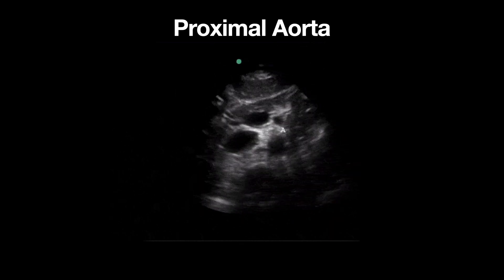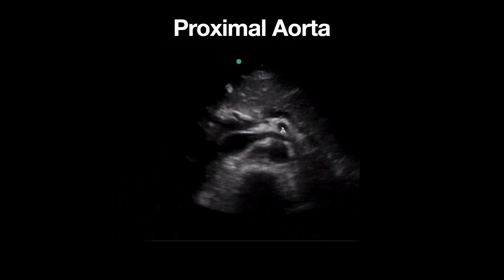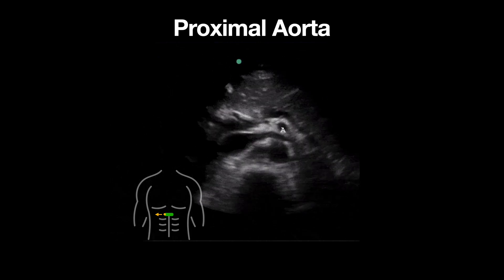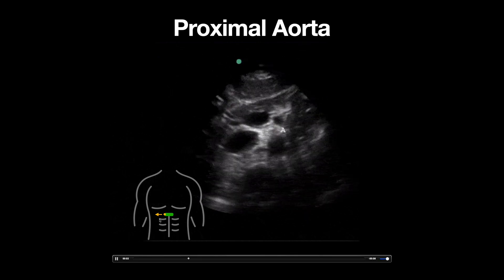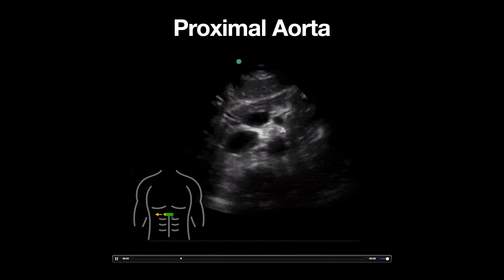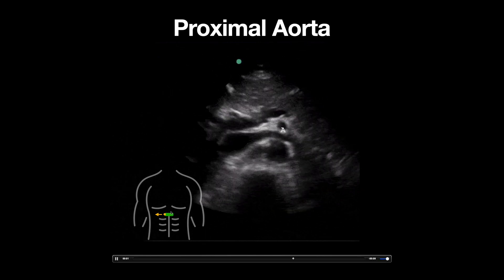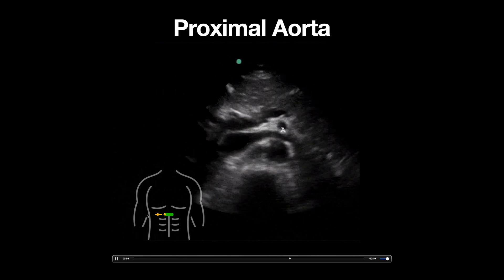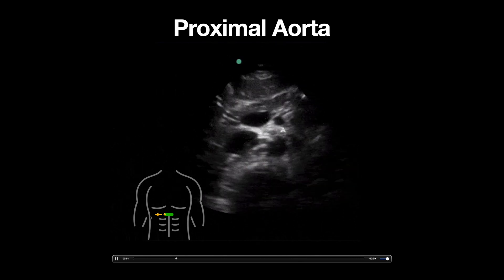This is an ultrasound clip demonstrating the proximal aorta. A curvilinear probe is used and placed in a transverse orientation in the patient's epigastric region, with the probe marker pointed towards the patient's right side.